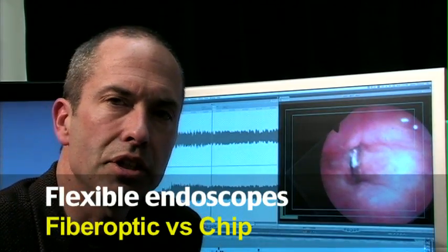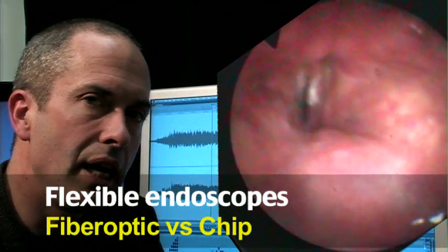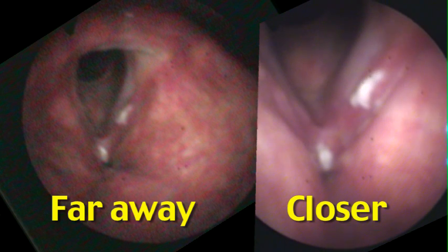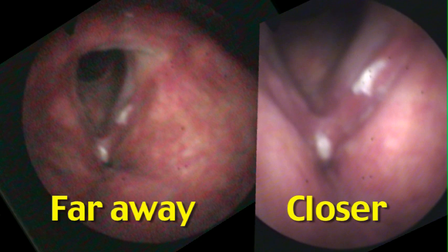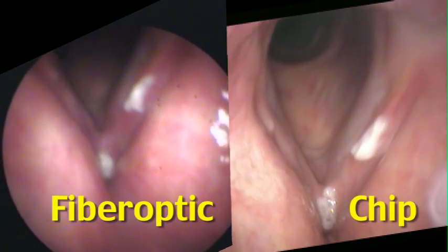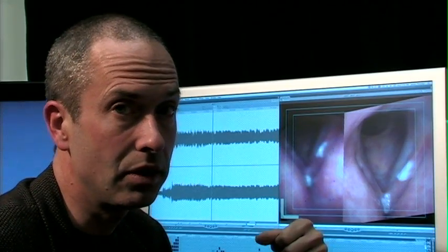Let's transition. Here's a patient where I've looked at them with both the flexible fiber optic and, a few moments later, with a chip endoscope. Before we even get to the chip endoscope, we can see that with the same fiber optic endoscope, the closer I get, the more light it sheds on the subject and the clearer the image. Switching to the chip endoscope and comparing the best fiber optic image to it — now we start to see detail about these white spots. We can see the little blood vessels on the cord. Essentially, it's a much higher quality image.